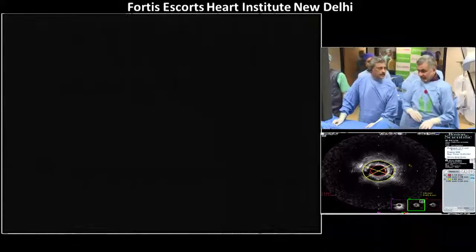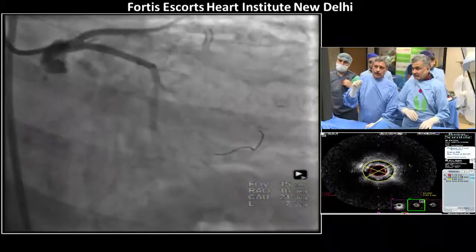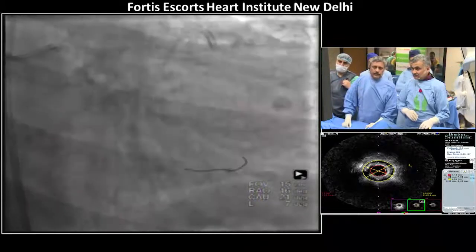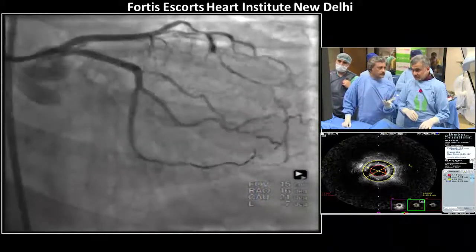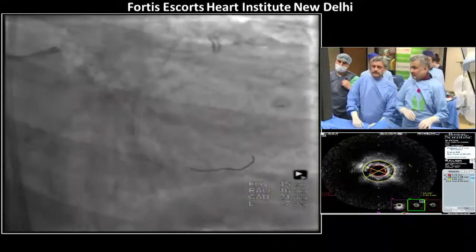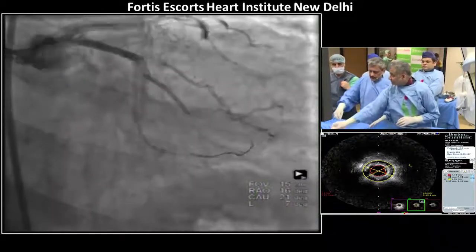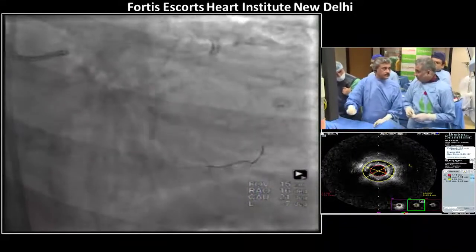Yeah, I totally agree. I think that's a good plan. So we'll put this second stent beyond the recently put stent. We'll not put too much metal proximally. Correct. There's already 2 stents proximally. Just enough overlap. Right. Can we have 2.25, 13? How much length?